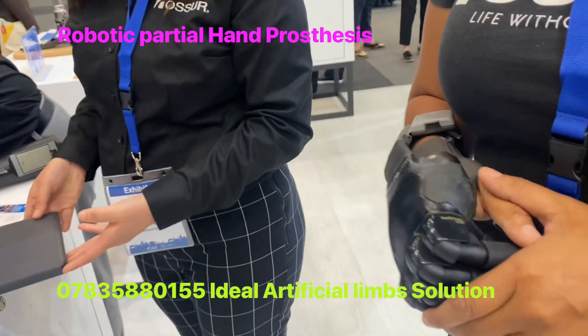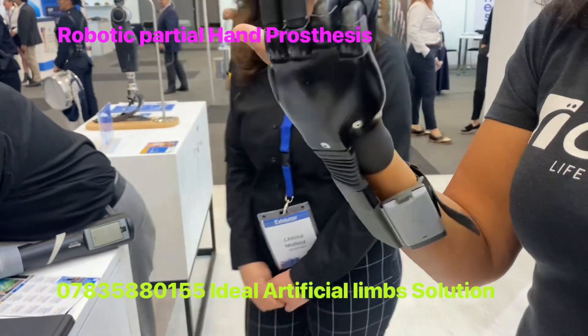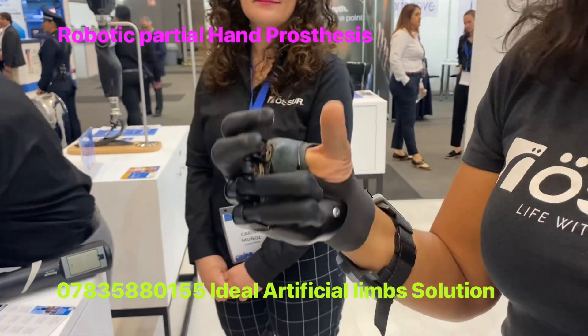Thank you very much. I think this much information about this robotic iDigit hand is really helpful for our patients from Ideal Artificial Limb Solution. Thank you very much. You're welcome.